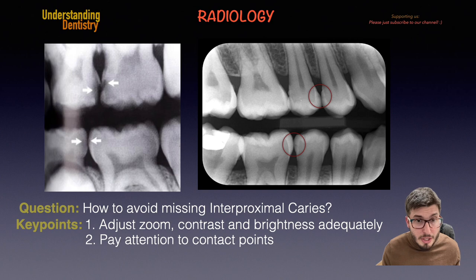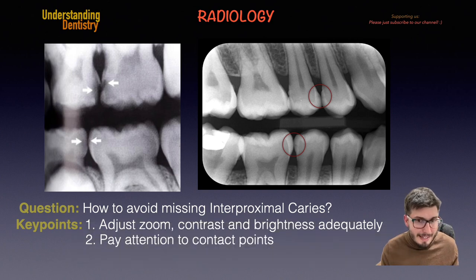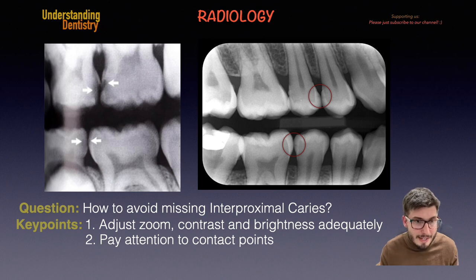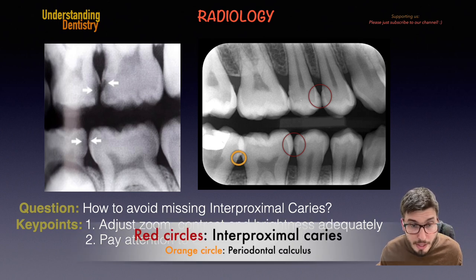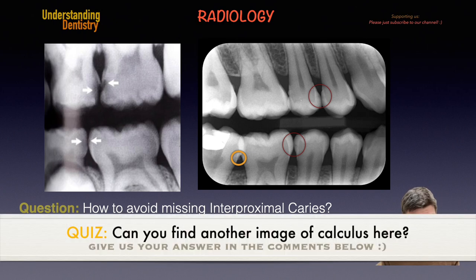We can differentiate initial caries from other alterations — for example, calculus. Calculus can happen in those interproximal spaces, but interproximal caries will likely happen on the contact points specifically.